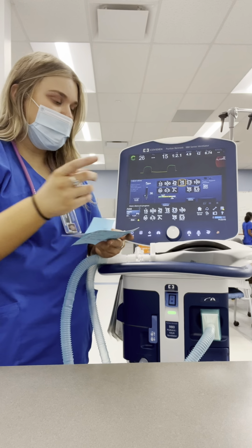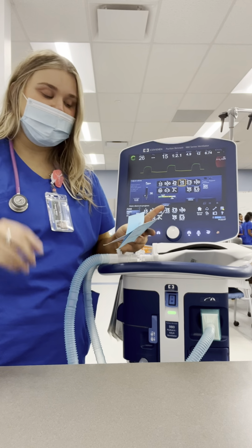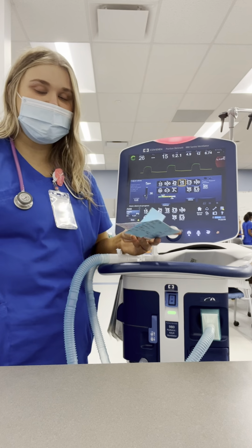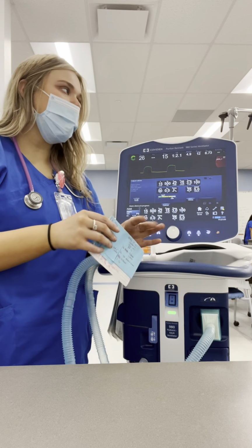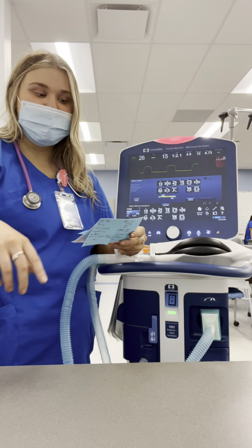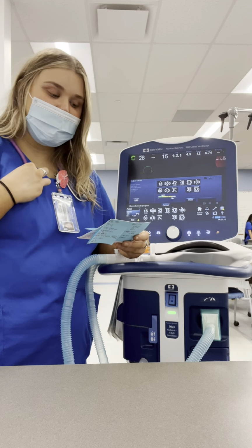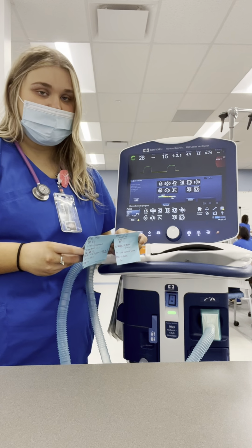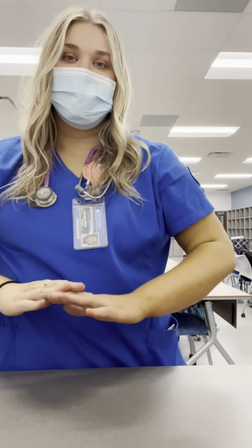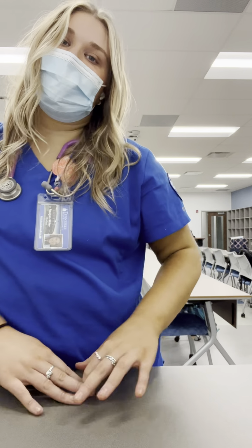And this is going to be used to augment a spontaneous tidal volume, and when that spontaneous tidal volume gets to 10 to 15 milliliters per kilogram, or we have a spontaneous frequency of 25 breaths per minute, the patient is ready to be taken off the ventilator. We're going to be sure to assess the patient's RSBI score and have it at less than 100, their NIF at greater than -20, the tidal volume, vital capacity, and the ventilation to ensure that they are ready to be extubated. Okay, so my patient was successfully extubated, and now we have them on a nasal cannula at 5 liters per minute.